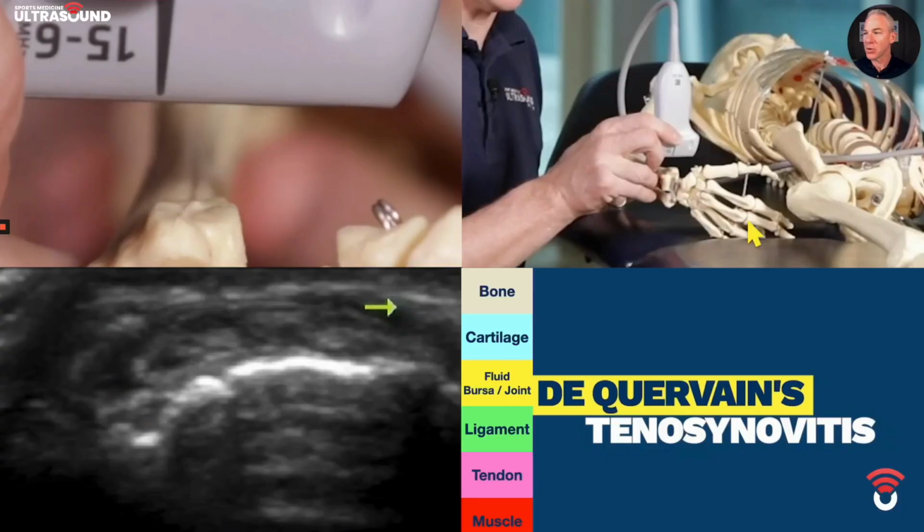Okay, now to draw it. So what do we see? Well, again, we're now seeing the bone of essentially the radial, the kind of the thumb side of the radius. So there's bone. So that's what we're seeing here. Now, can you see tendon or can you see cartilage in this view? No. Fluid? No. So we're going to go straight all the way to tendon.